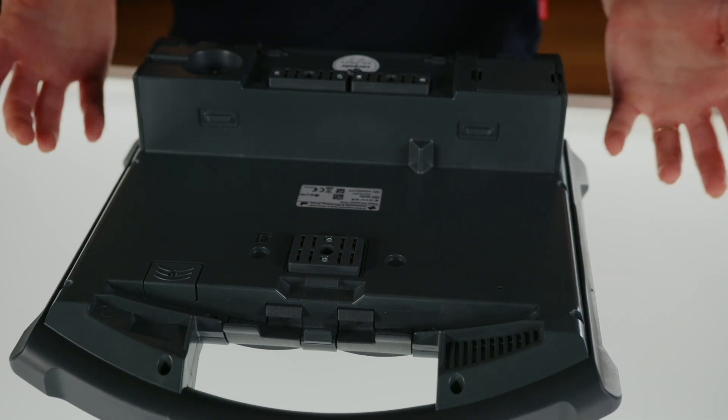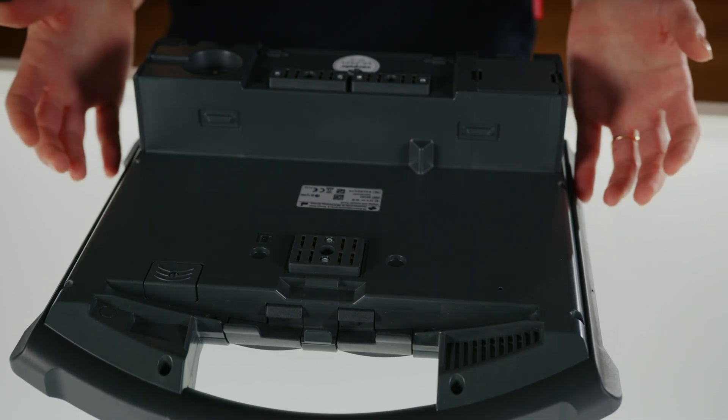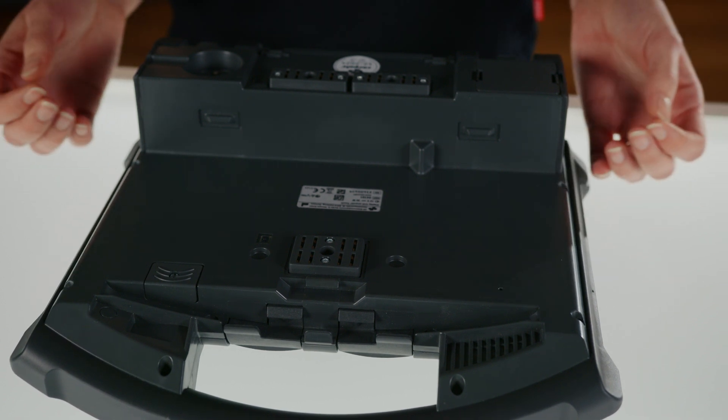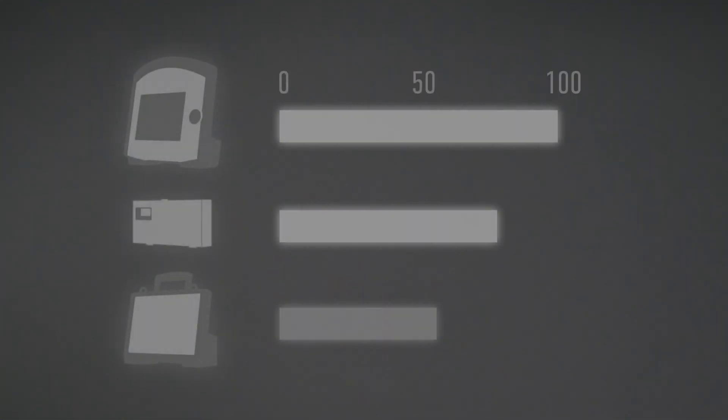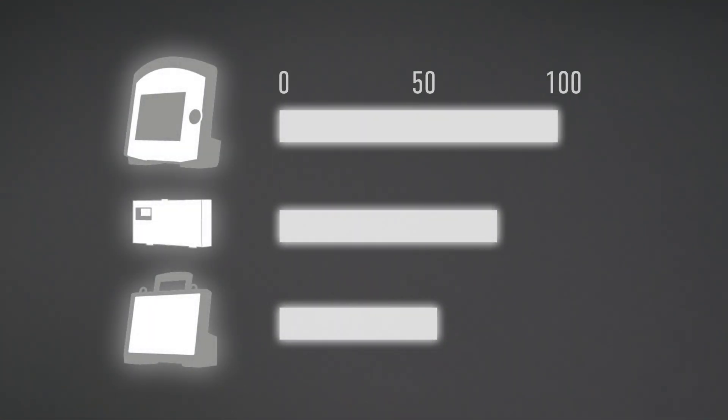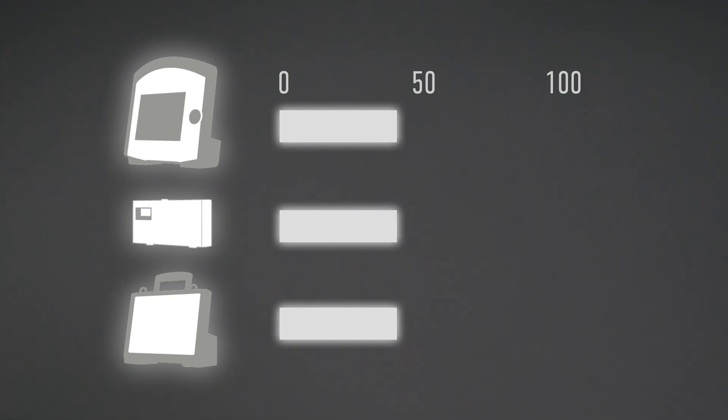To ensure that the connection between the three modules works smoothly in compact mode, it is important that all infrared windows are kept clean. Generally, a battery is installed in each of the individual modules. When the device is in compact mode, the battery with the highest charge capacity is always used first. From the moment that all battery levels equalize, they will be discharged together.